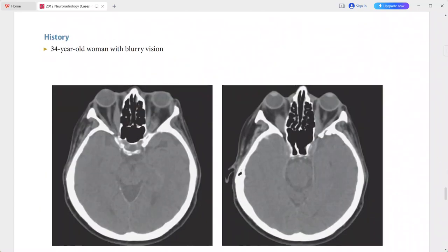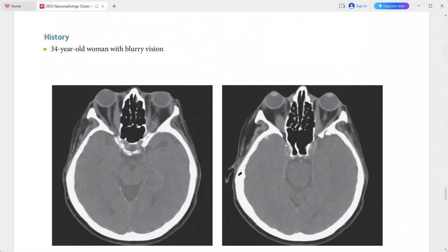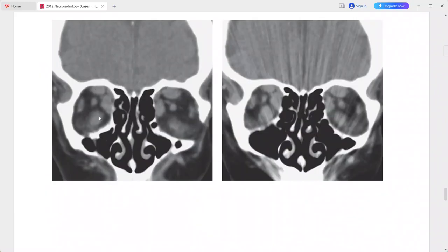Next is a 34-year-old woman presenting with blurred vision. CT images show enlargement of the inferior, medial, and superior rectus muscles in both orbits. However, the lateral rectus muscle and oblique muscle appear relatively spared and are of normal size.